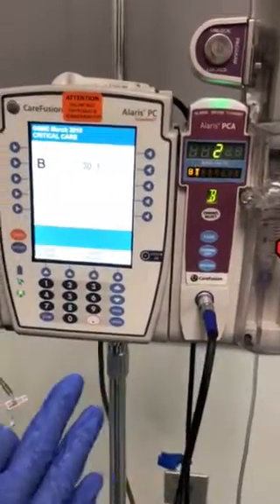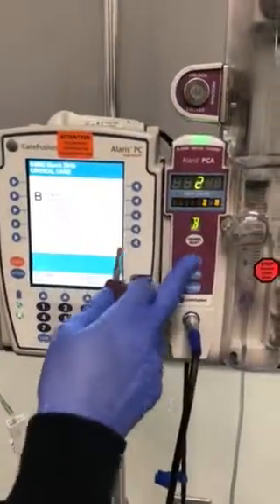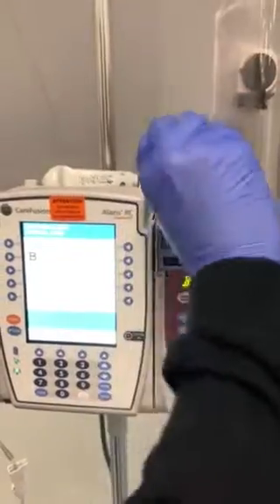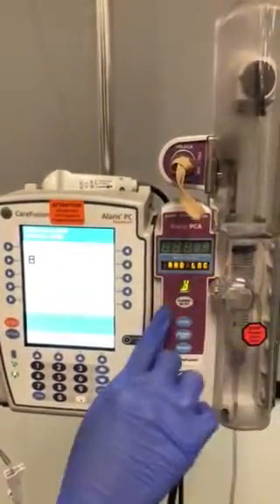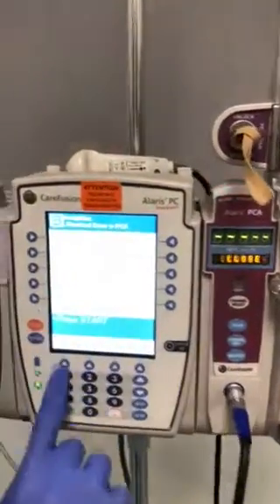If your orders have changed and you need to reprogram your pump, select pause. Use your key and select program — it will beep. Hit channel select and then go to program.